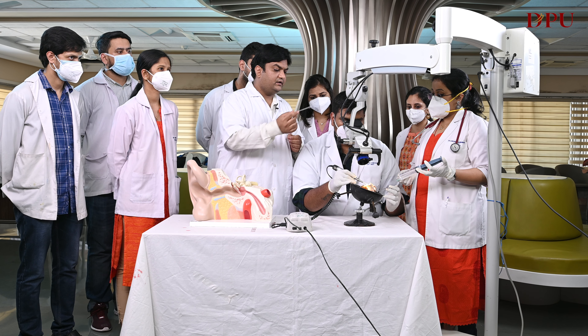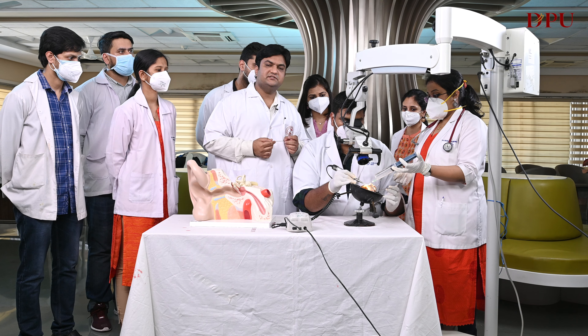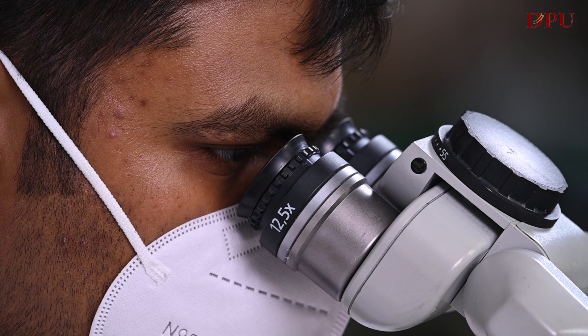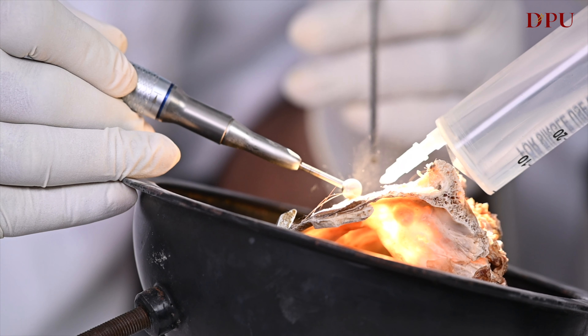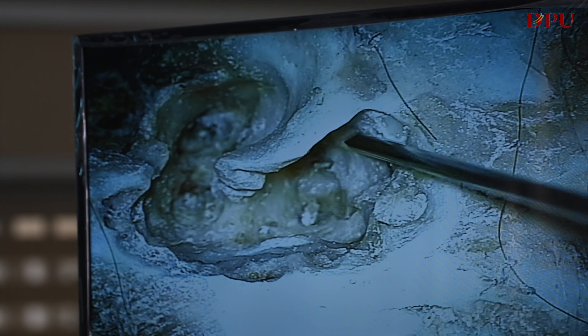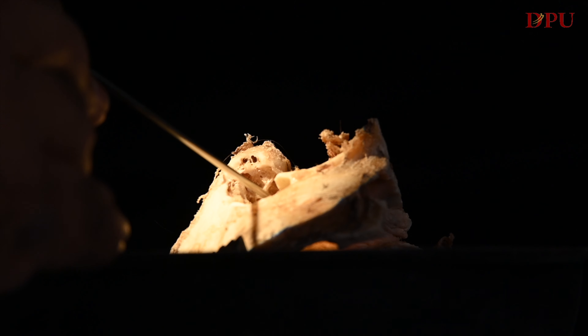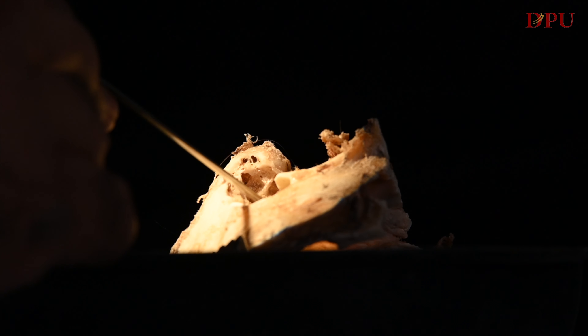Along with it, the other resident will be assisting, and there will be a few observers with us. After the drilling, you can see this is the dural plate, this is the sinus plate — there is a slight breach in the sinus plate — and this is the mastoid tip. We complete the cortical mastoidectomy and identify the structures as below.